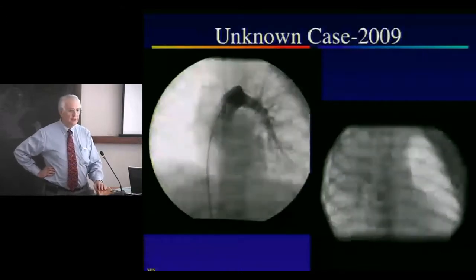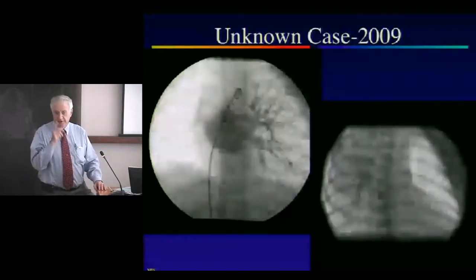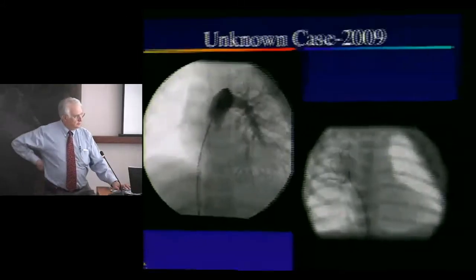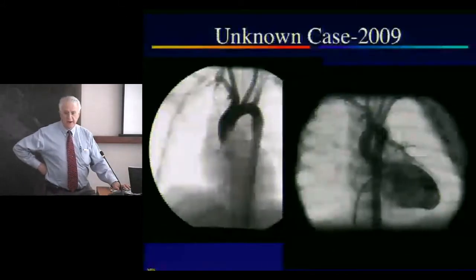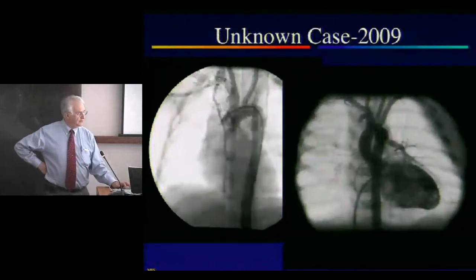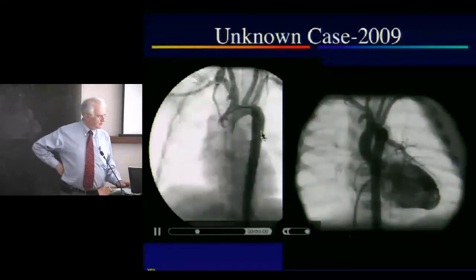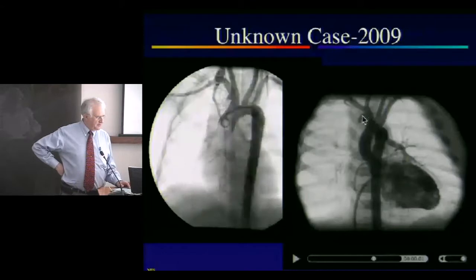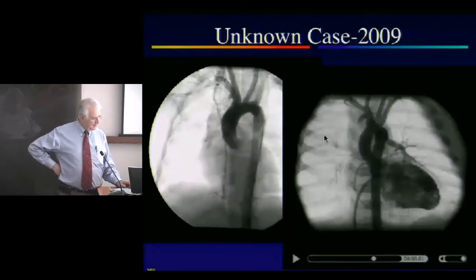Well, what happened was there was a ductus on the right side, and the ductus had constricted off. Isolation of the right. Isolation, and so we gave the patient prostaglandin at 3 days of age. And look here, what you see off the base, confirming Dr. Sanders' earlier findings, the base of the innominate artery is starting to come off a little thingy, which as we progress further gets even bigger. So I'll let this play.